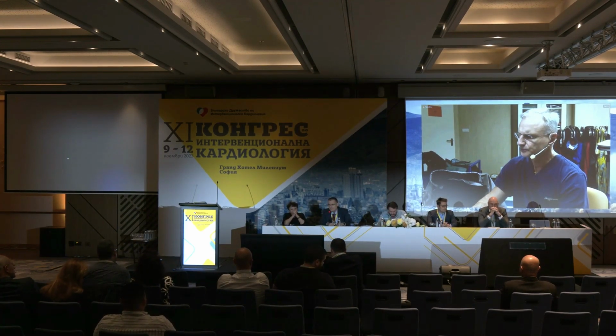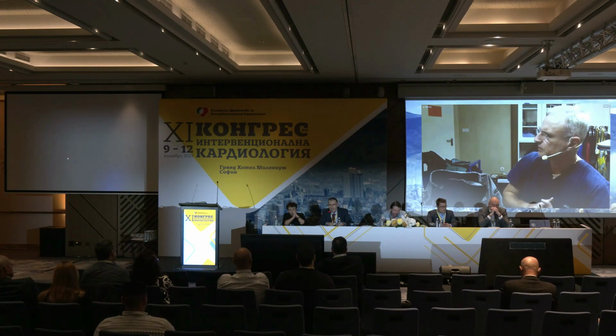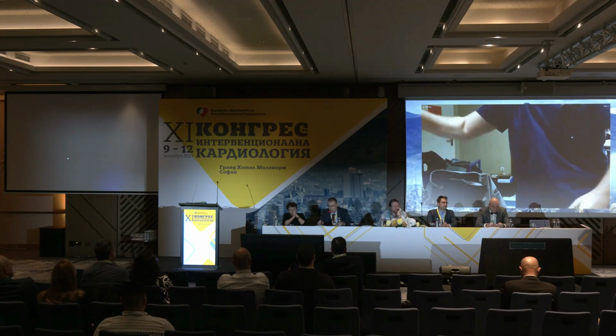Thank you, George. For the sake of time, we have to proceed. I would like to ask you just to join the team in the cath lab, just for the case. As far as I know, you will be the operator. We have a patient on the table, so we're ready to move on, and maybe during the case we will discuss. Go to the rest of the lab centers and we will come back to you soon. Thank you. Okay, thank you so much.